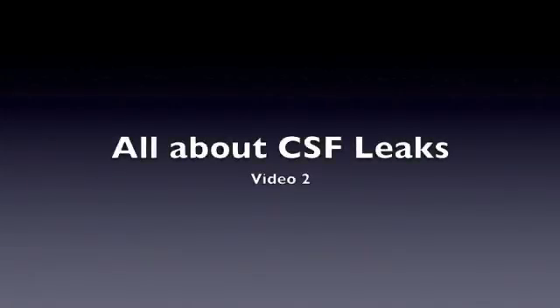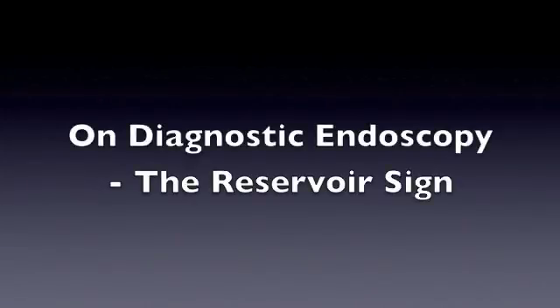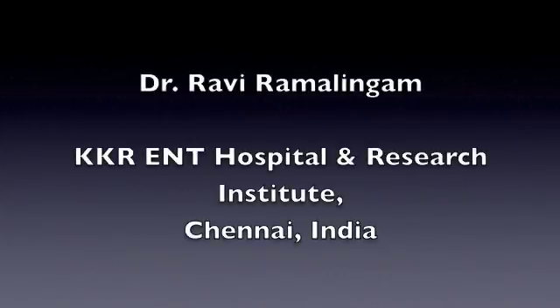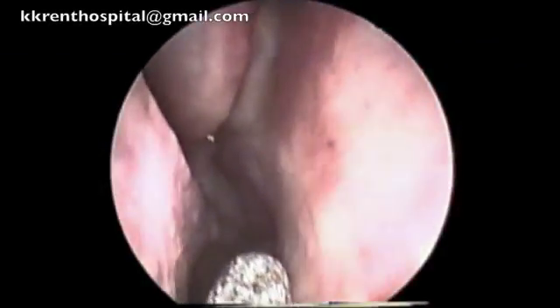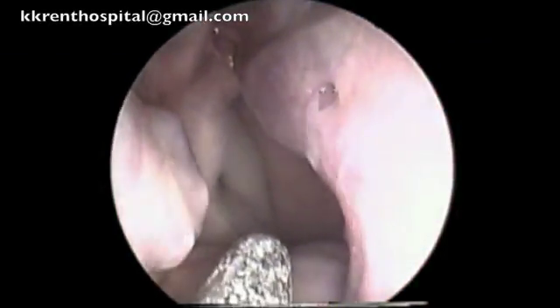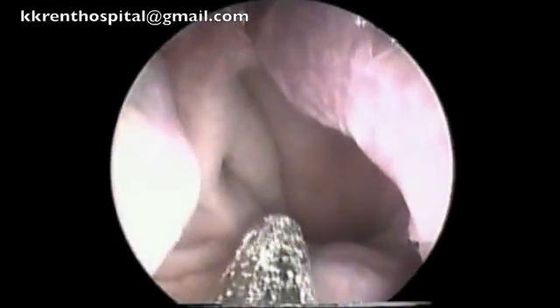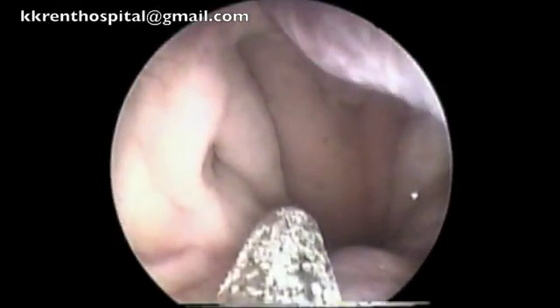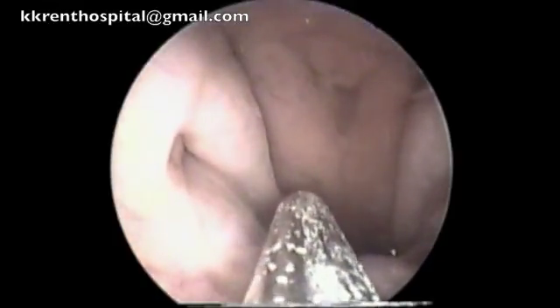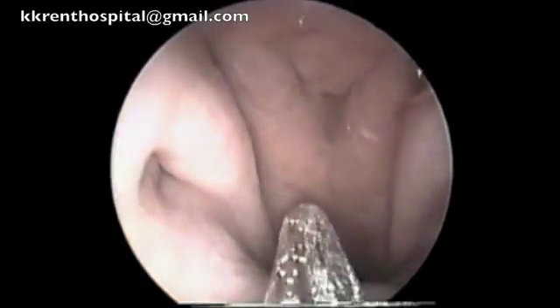Hi, in this video clip I'm going to show you what diagnostic endoscopy sometimes looks like in a patient with a profuse CSF leak. Nasal endoscopy is being done on the right side and you see the entire nasopharynx being filled with the CSF leak.